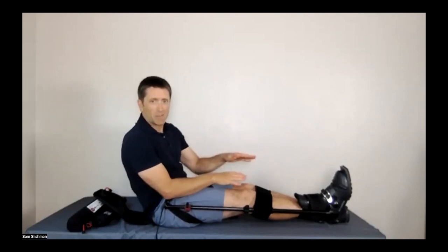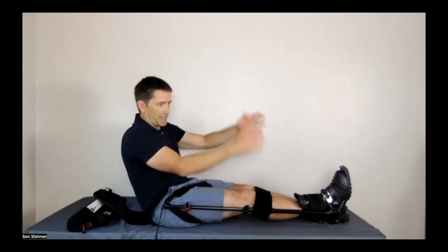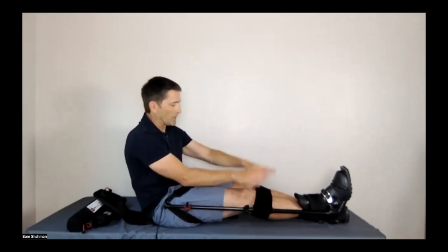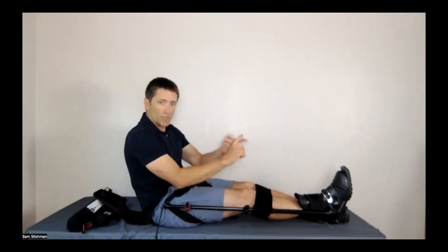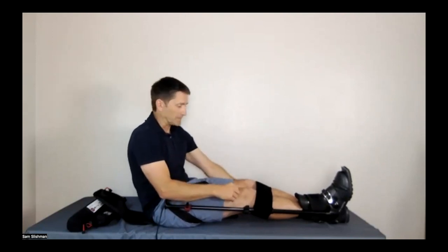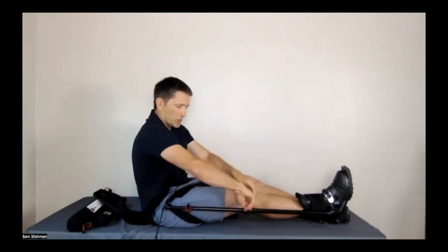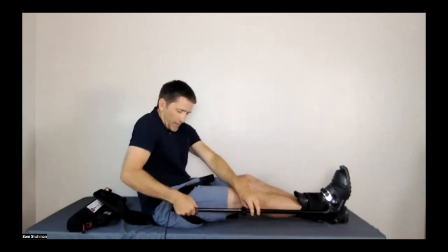And mind you, that doesn't have to be the end of it. As I said before, you can put in a vacuum splint, you can put all kinds of straps, but this gets the job done of traction plus splinting. I'm going to take this off and just show you one other quick thing with this splint.